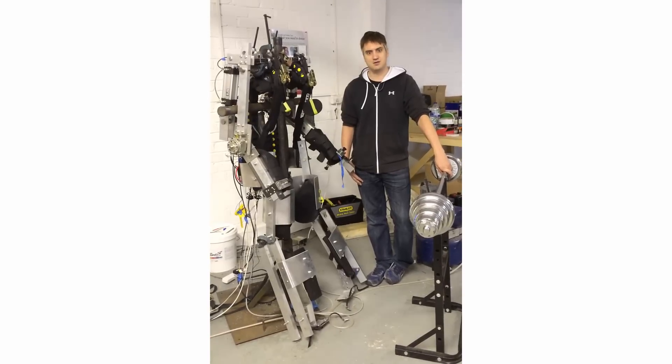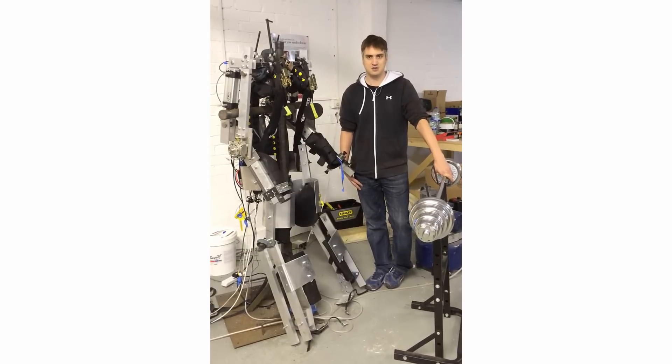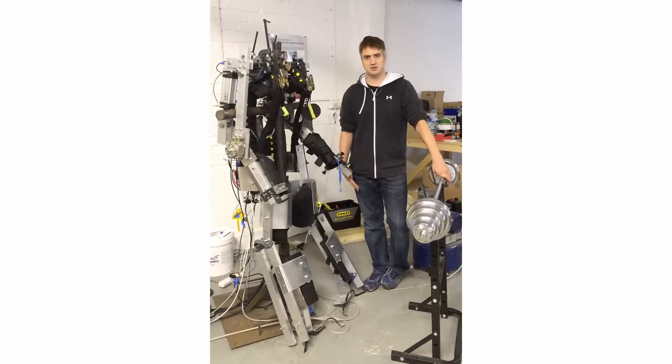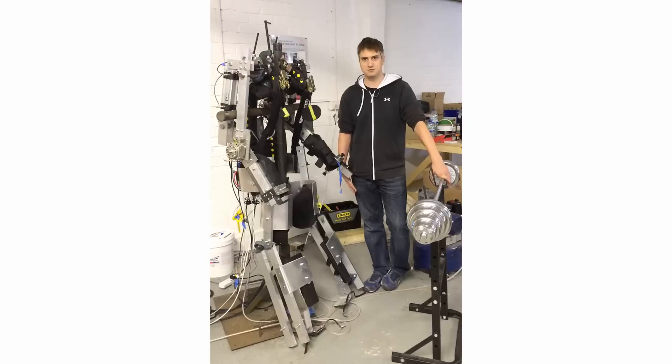Just a note for the videos that follow: we're running at half pressure and half strength at the moment, which is why it's only lifting 50 kilograms. If we were to run at 10 bar, we would be capable of lifting probably 100 to 150 kilograms.